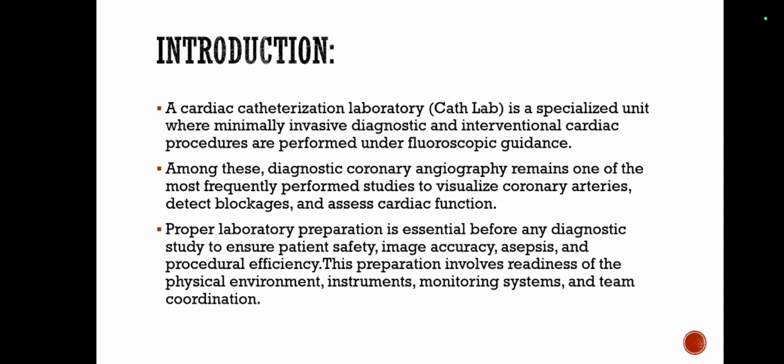under fluoroscopic guidance. So, cath lab is a place where we do small interventional diagnostic procedures like coronary angiogram, angioplasty, balloon valvuloplasty, and a few other procedures too. So, among these diagnostic coronary angiography remains one of the most frequently performed studies to visualize coronary arteries, blocked arteries, and also to assess the cardiac functions.